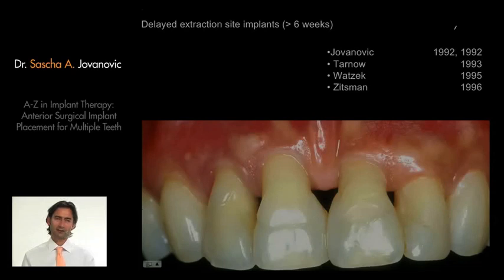And what you can see here is 2 central incisors and 2 lateral incisors with thin gingival biotype, with a frenulum pull. And these 4 anterior teeth are missing or are failing. And the first thing to evaluate then is really, when we look at this here, how good are we going to be in the grafting procedure?